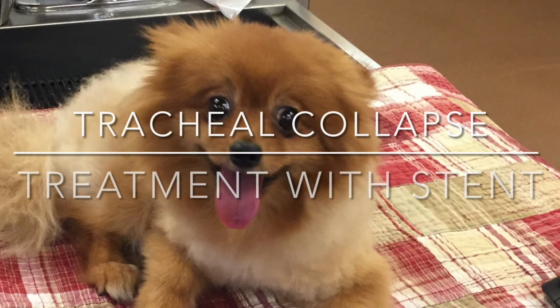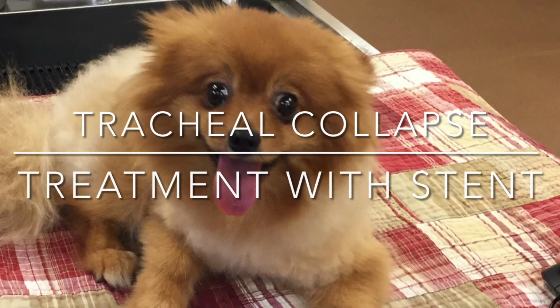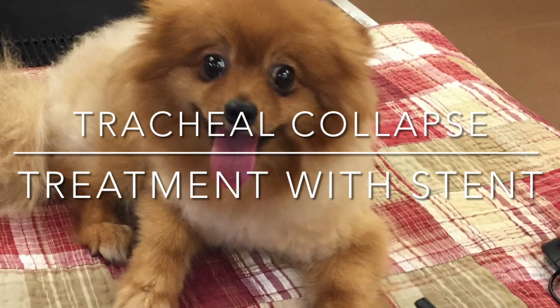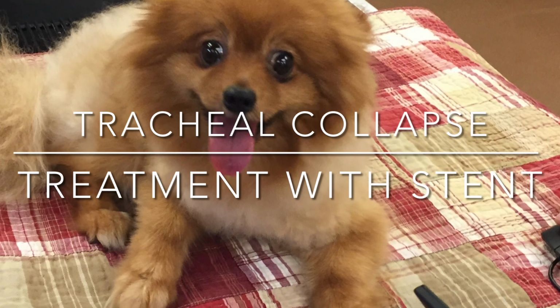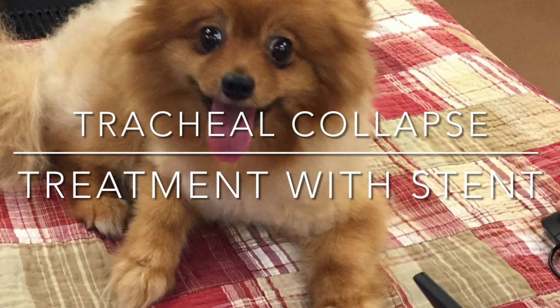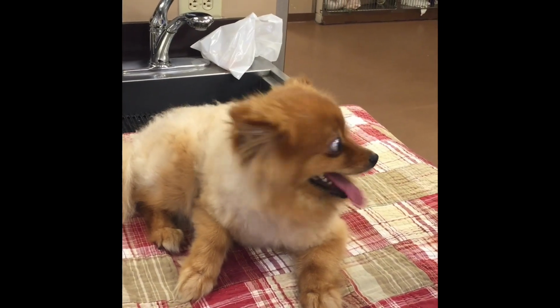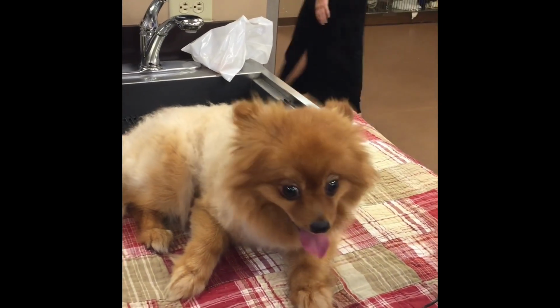This is a 2-year-old dog who has difficulty breathing due to tracheal collapse. Today, we are going to place a tracheal stent in order to help this dog achieve a better quality of life at home. This video is of the dog prior to the start of procedure. Note the breathing pattern.